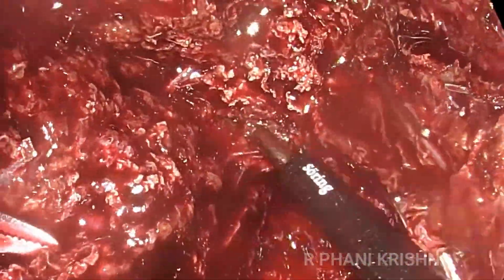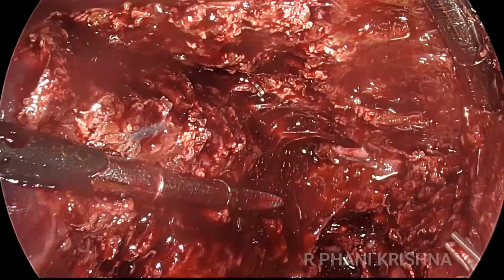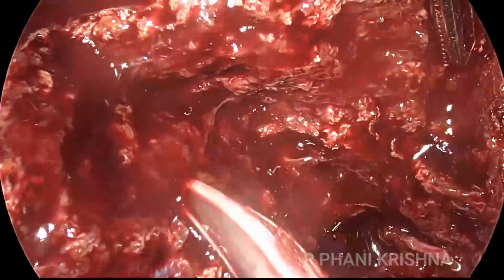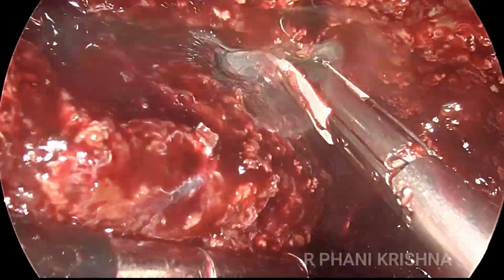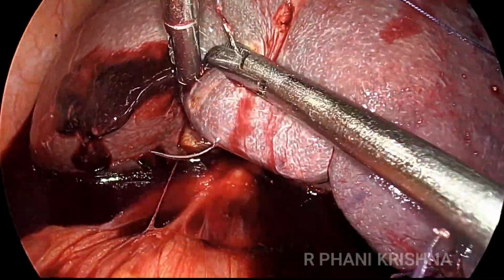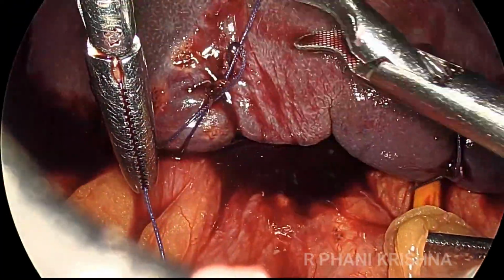So once we cross the midline of the wedge and onto the other side, independently, of course, this is an intermittent Pringles. We are doing it every 15 minutes. We unlock the Pringles for 5 minutes. In the non-anatomical resection, it's a useful idea to use Pringles to reduce the bleeding.